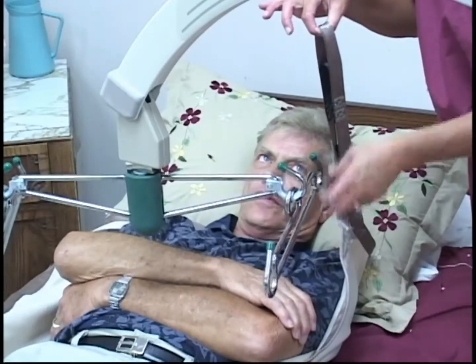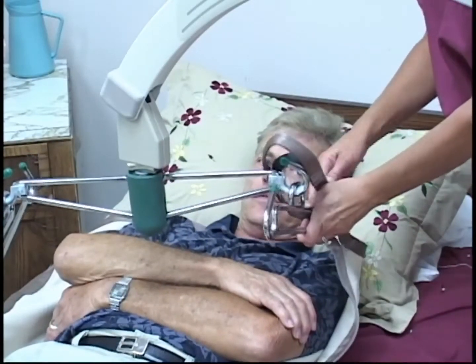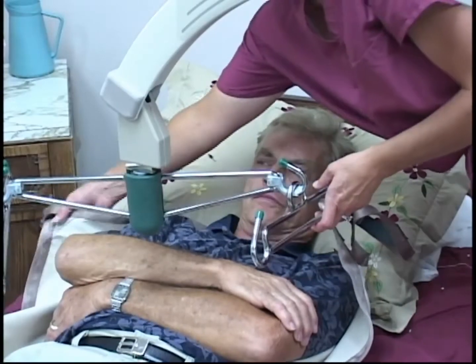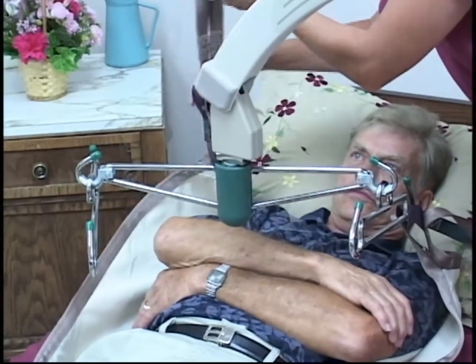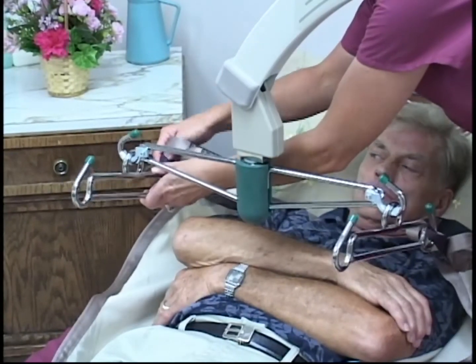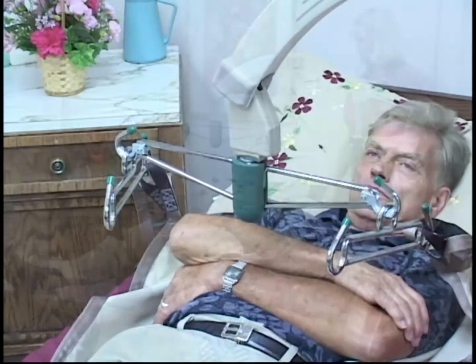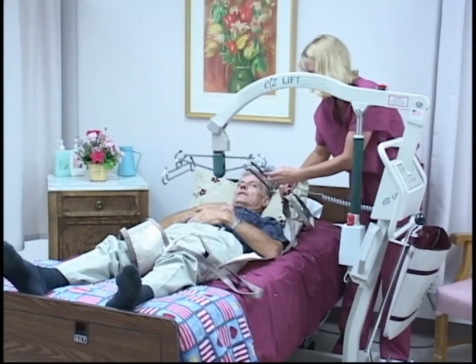Each sling has 3 different loops. These loops are used to determine the position of the patient. The shorter loops bring the patient to a more upright position, and the longer straps leave them in a more reclined position. Typically, applying the shorter loops on the back and middle loops on the front provides a comfortable transfer.